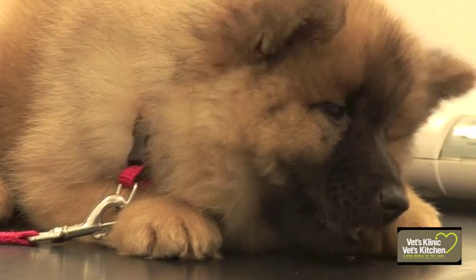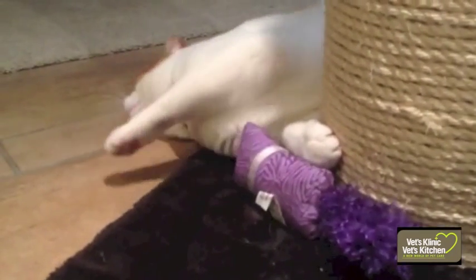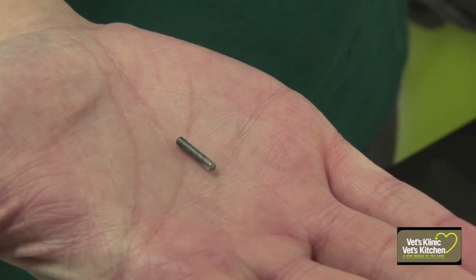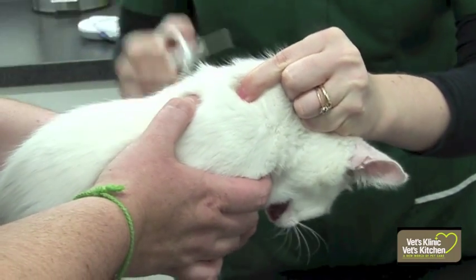If your pet doesn't have a microchip already, it's a really good idea to have one placed because this gives them the best chance of being identified and reunited with you if they were ever to get lost or stolen. If you've never seen one, the microchip itself is really tiny, about the size of a grain of rice, and this is inserted under the skin at the back of the animal's neck, normally between the shoulder blades, so it's nice and easy to locate.